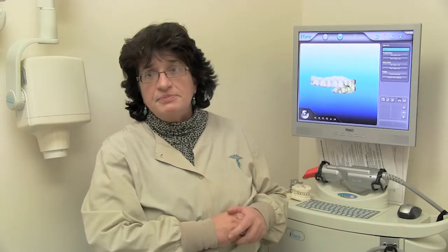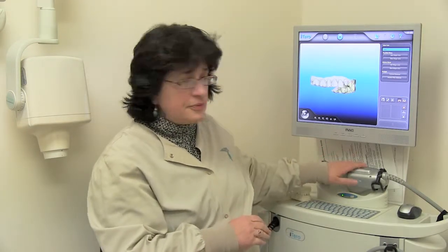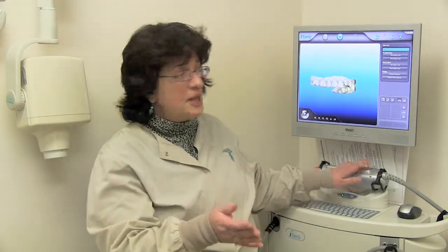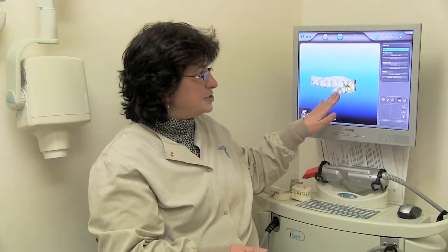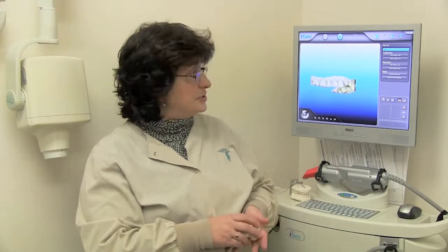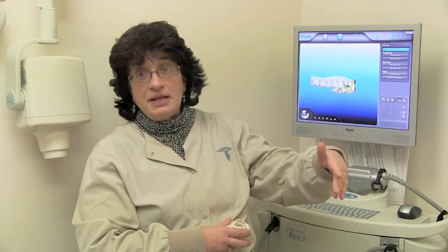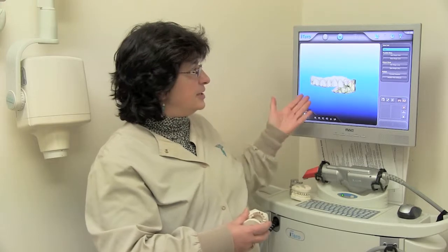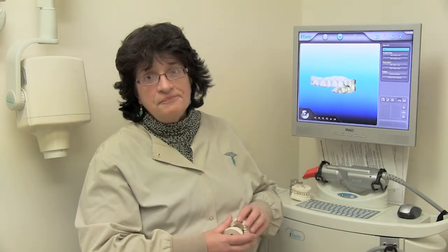And then this digital acquisition unit. We don't any longer put impression material in people's mouths. We use a scanner that has a trifocal beam laser, and it scans the dentition, and then we get a model representation on our computer. The luxury is that we don't spread germs by taking the image here. None of the bacteria is being sent to my laboratory. The accuracy of this is much better than our materials. It's not compromised by the humidity, so everything's dimensionally stable. So it's really the advancement for dentistry.